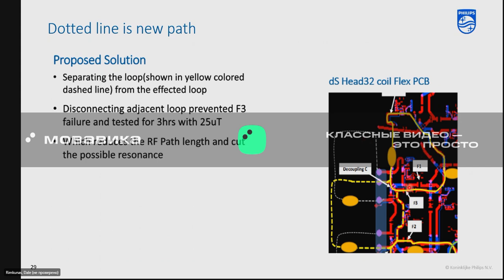It's being tested. Prototypes have been made. I don't have a date yet when this is going to be released, but the problem is identified and being dealt with. Any questions about 32-channel head coils?